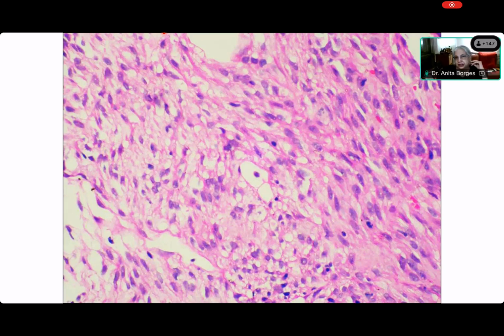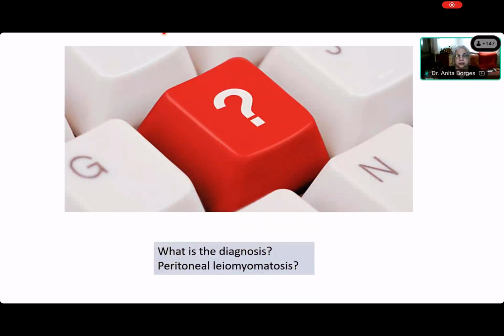It does, right? Okay, because now the patient can have many different kinds of tumors, so it's the same. So now what are we going to call this? Peritoneal leiomyomatosis. What do you think, Chandana? It happens in females, so maybe it's happened in this male as well.